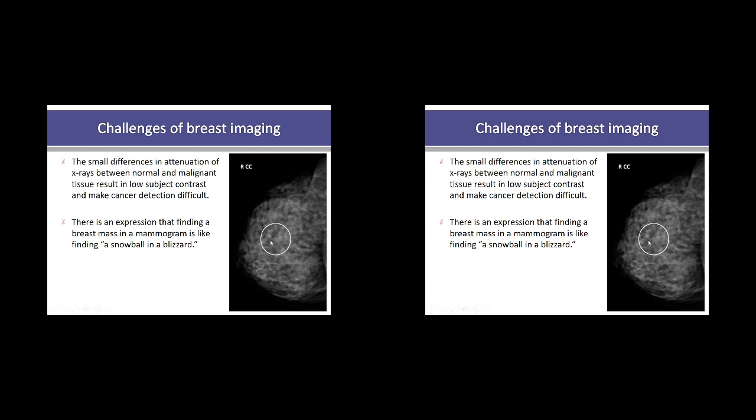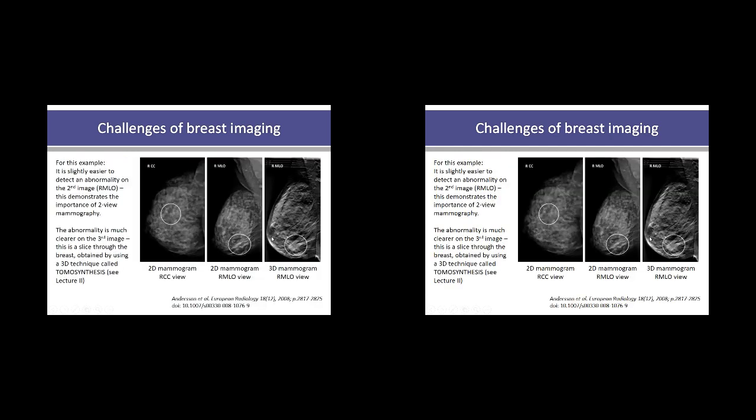Now, it is possible that a radiologist didn't pick up a cancer in the CC view. And so I've got all the examples here. This is why doing two views in conjunction can be quite beneficial, because when you look on the MLO view, it looks slightly different. It has a slightly different structure within that circle that you're certainly not seeing here.